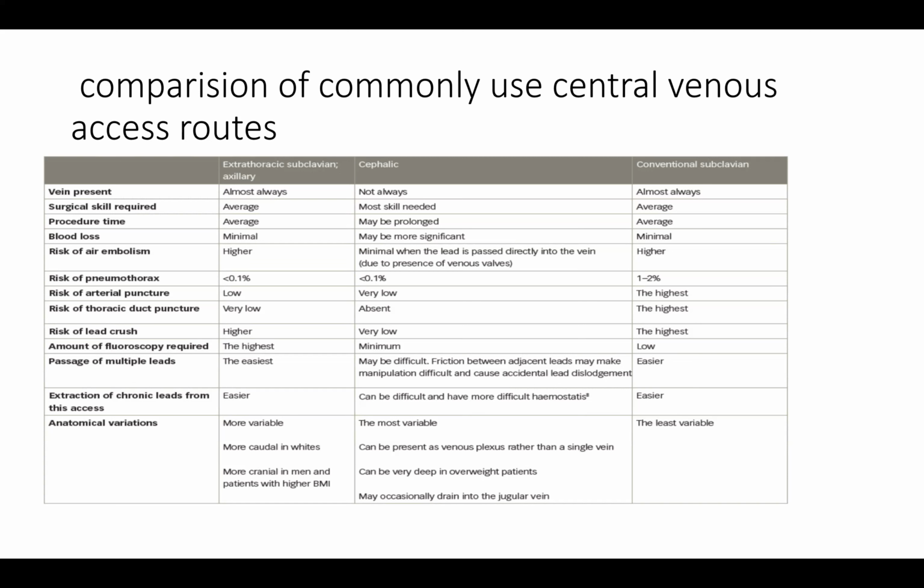Arterial blood is red. Then two, the force of the blood, as if you are not in the vein when you take out the needle. Some of them, as if you are not in the vein. I did a dual chamber pacemaker today after church. I was in the vein. I was telling my assistant, look at it. I removed the needle, I removed the syringe and looked at it. I said, there is no drainage here, but we are in the vein. We pass in our wires and it goes well.